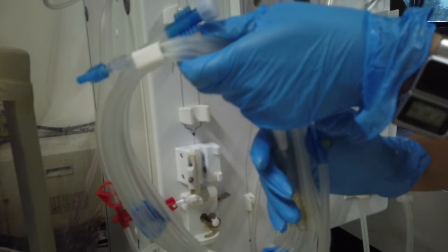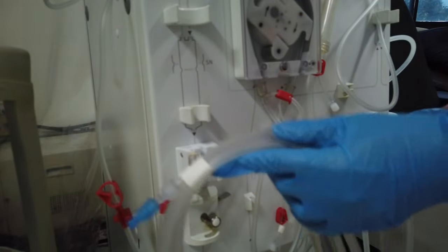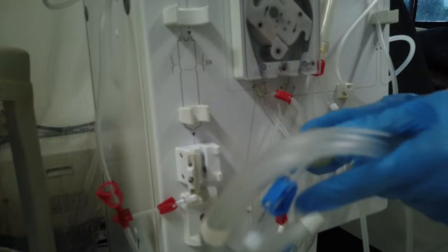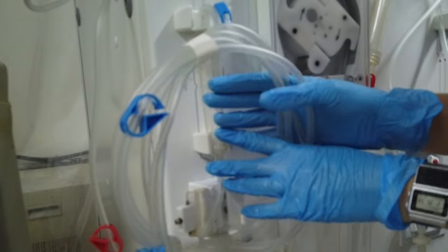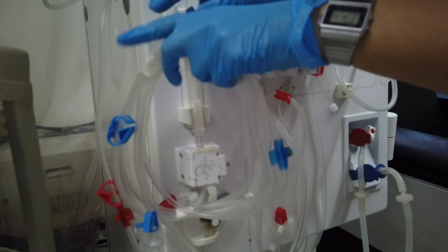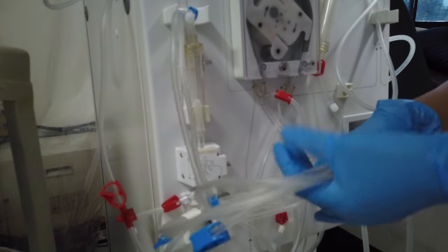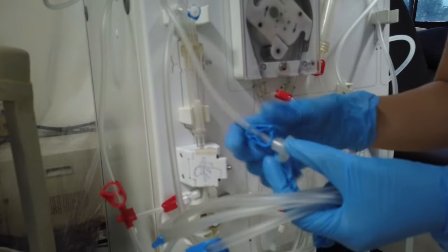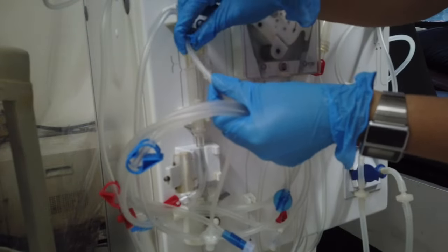Let's move on to the venous line. Just like what we did with the arterial line, we are also going to start with the drip chamber. However, this time we are going to put it in the proper direction and not in a reversed manner. Then thread the lower line into the air detector housing and close the small clamp just above the drip chamber. Also include the transducer clamp. Move it closer to the top part of the drip chamber for the water to not easily reach the transducer.